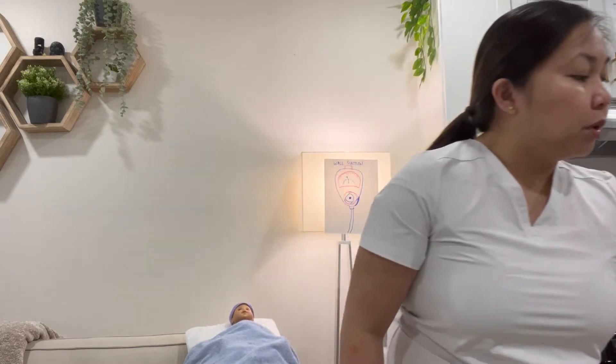For the tubing, you would like to use the size appropriate for the patient. If your patient is an adult, use size 10F to 16F. If it's an infant, use size 5F to 6F. And if it's a child, use between 6F to 10F.